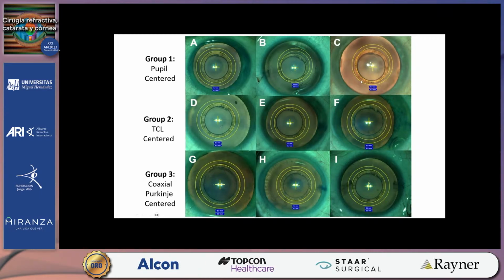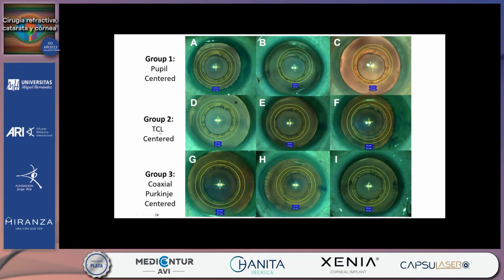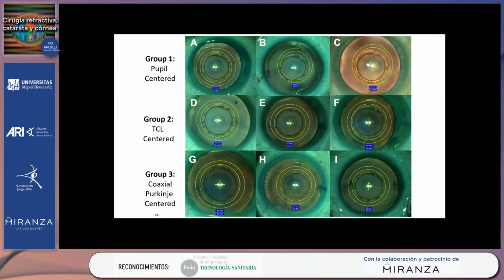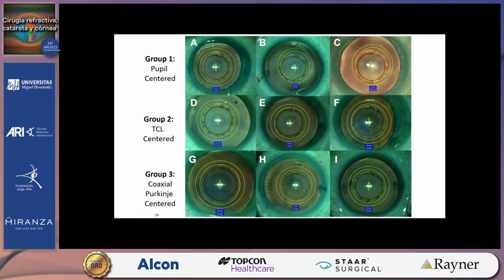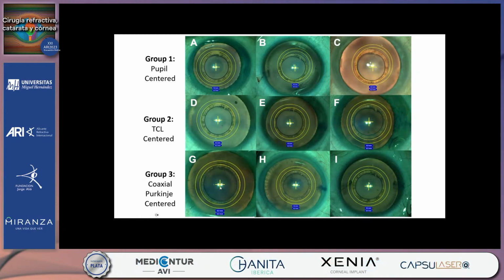This is what we were seeing in the other images, that when the IOL is there, with the 6mm optic body, the capsulotomy can be very close to the edge. Now, looking at the trypan capsular landmark group, we see excellent consistency with the capsulotomy being centered on the visual axis and 5mm being achieved. And this is what we're seeing with the IOL body too. It's nicely spaced around here, allowing for some deviation. Here we have slight deviation, very minor, and I think we'd all be happy if we had that as well.